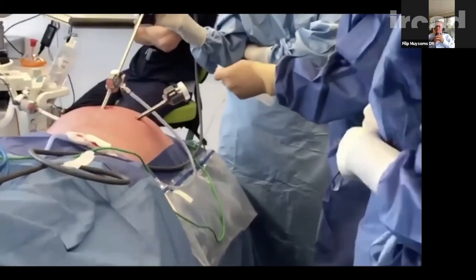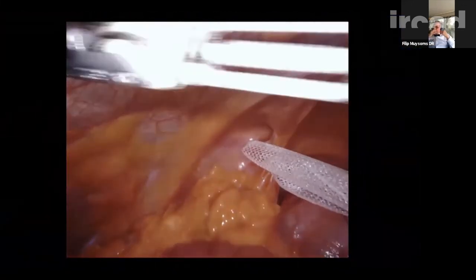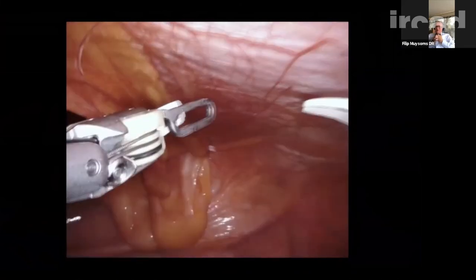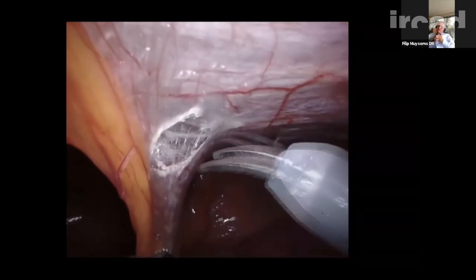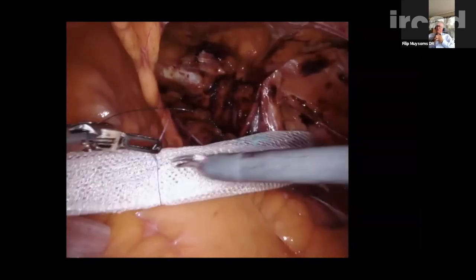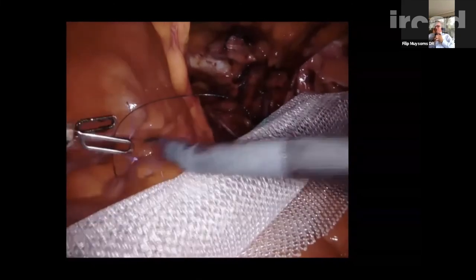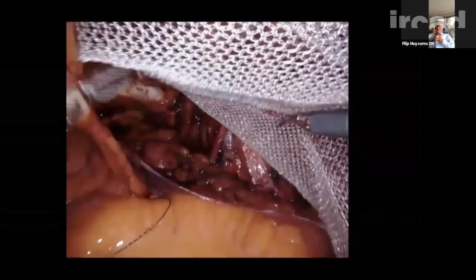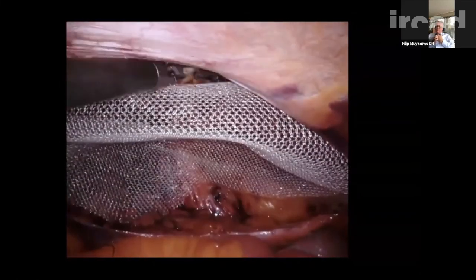A second patient with a medial groin hernia is shown, though not the full dissection. This case illustrates why a checklist for the 10 golden rules would be valuable — Philip was focused on trying the new mesh and realized at the end of the operation that he forgot step 7. Just as we have a safe surgery checklist, having a checklist at the end of the operation to verify all 10 steps were completed would help ensure consistency.